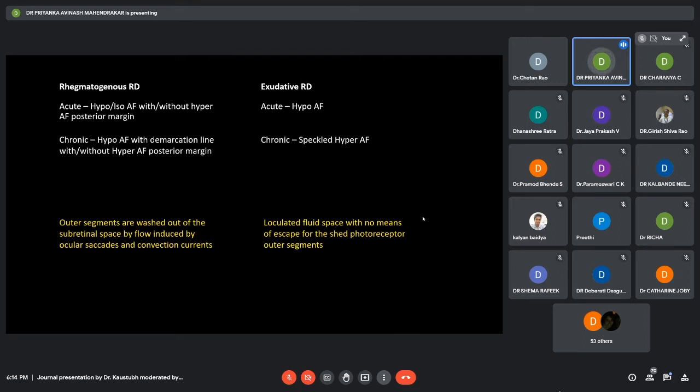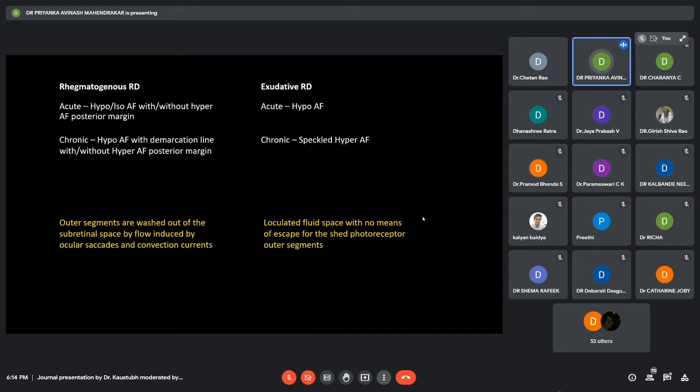In chronic rhegmatogenous retinal detachments, there is hypo-autofluorescence with a demarcation line with or without a hyper-autofluorescent posterior margin. Whereas in exudative RD, it is not hypo but it is speckled hyper-autofluorescence. The hypothesis behind this is that in rhegmatogenous RD, there is an escape for the photoreceptor outer segments because of the flow induced by the ocular saccades and the convection currents.